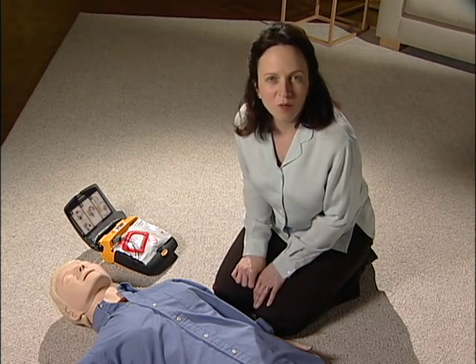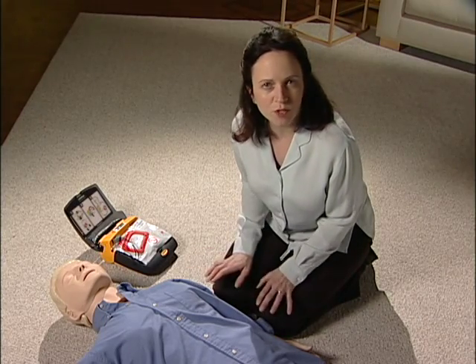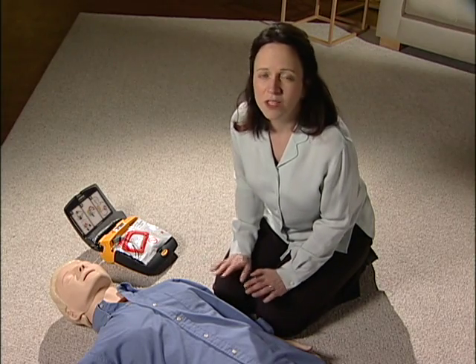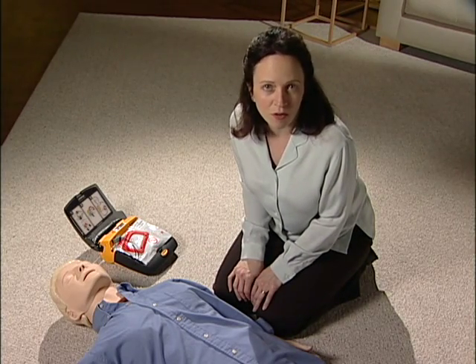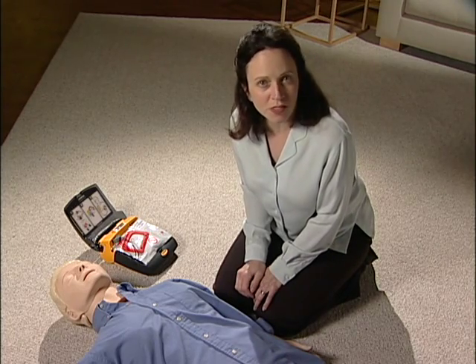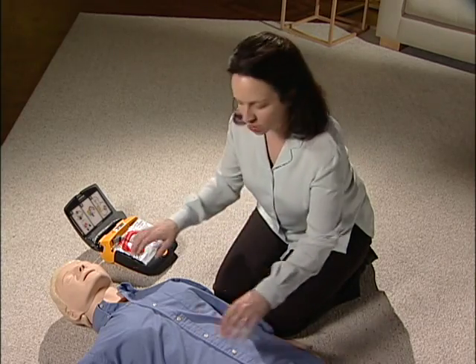You've already called 911, so start getting the clothes off their chest. Do whatever you have to do to clear the clothing quickly. Lift it, tear it, or cut it off. Don't waste time being nice to the clothes. Some versions of the LifePAK AED come with a kit that has a pair of scissors, but in this case, the fastest way is to just tear open the shirt.